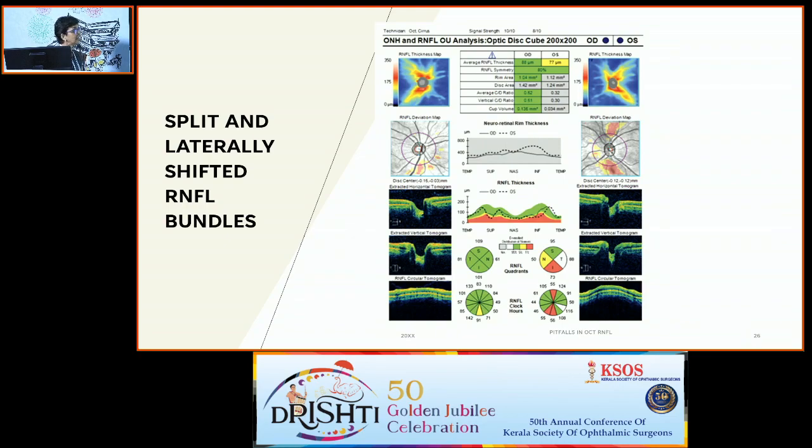So the red disease, where we label a patient as glaucomatous, leads not only to an unnecessary diagnosis, it also leads to unnecessary treatment and the side effects of that treatment, and also to unnecessary litigation.